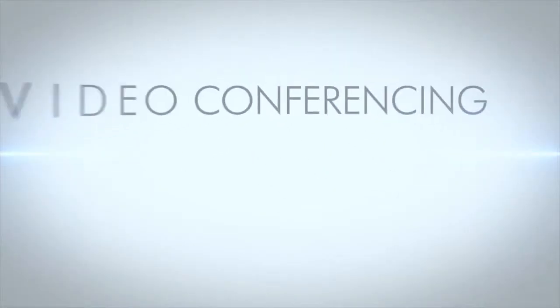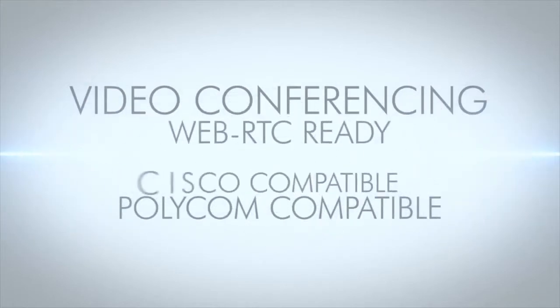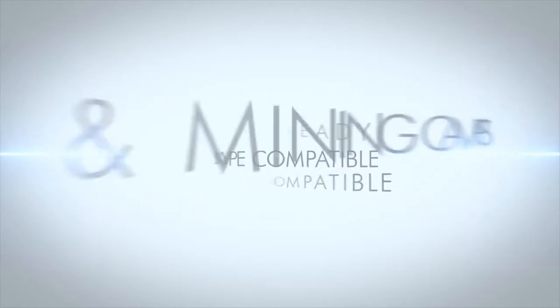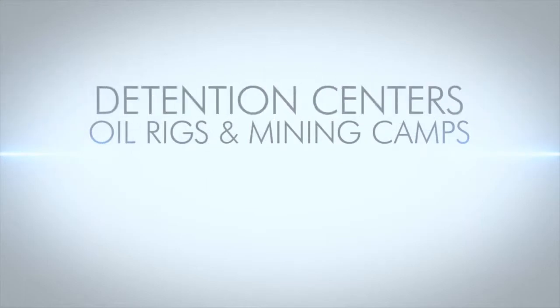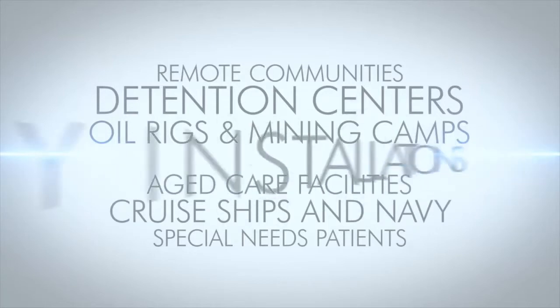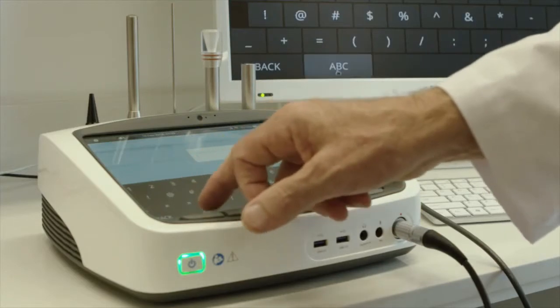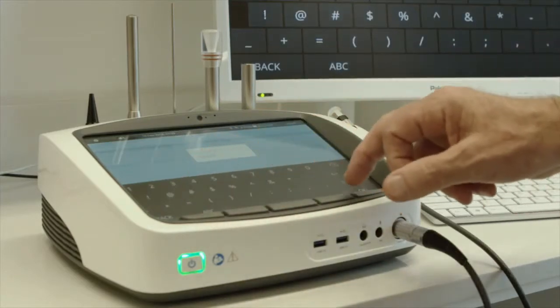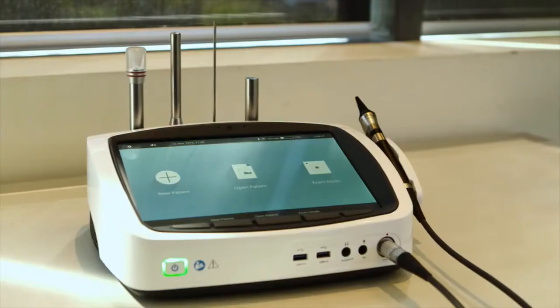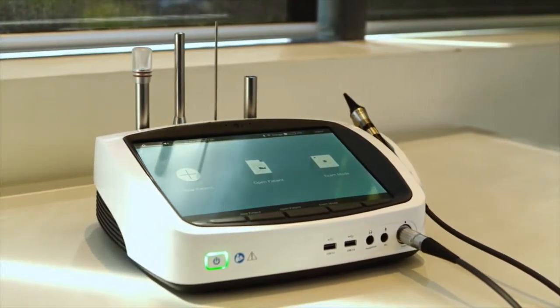A USB output allows the Pro-EX to be connected to any notebook PC for use as a webcam, with Skype or with other video conferencing programs. The Pro-EX allows patients with limited access to specialist services to connect via video conferencing from their local health clinic to include the specialist in the examination. Utilising the multifunctional capabilities of the Pro-EX through the video conferencing link often eliminates the need for patients to travel to the specialist, thereby saving time and money for the patient, the specialist and government health services.